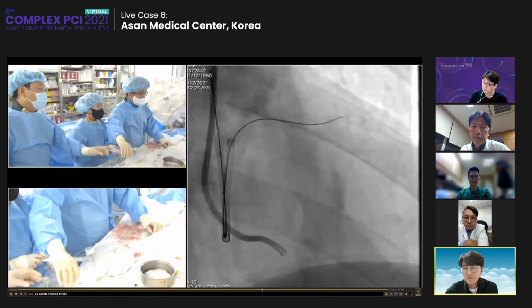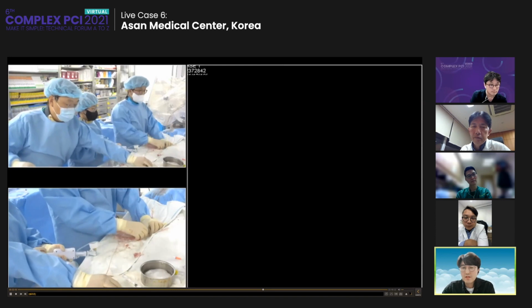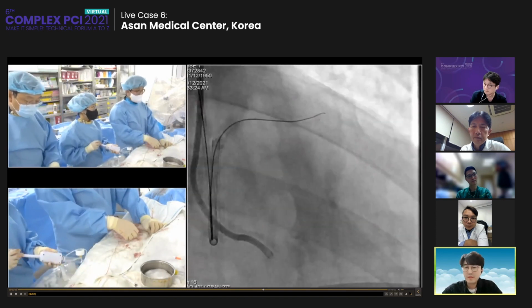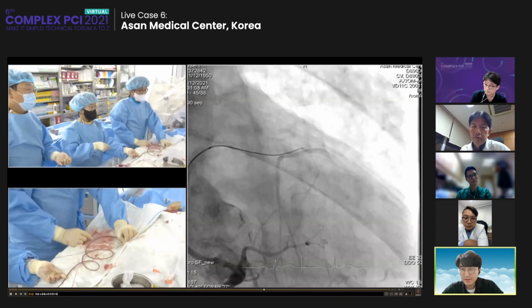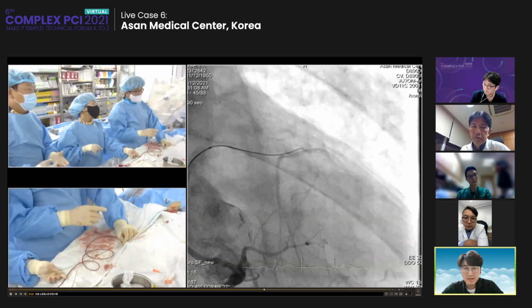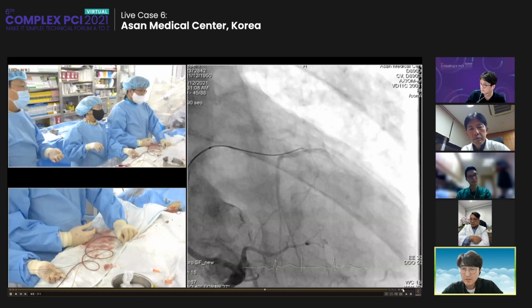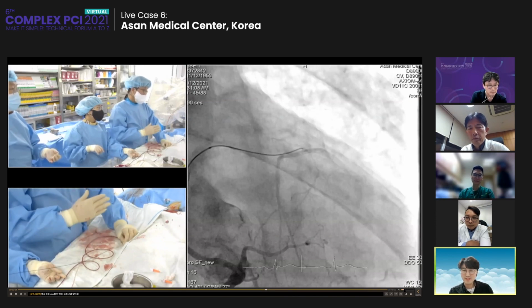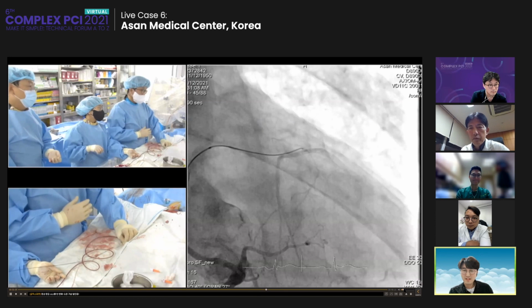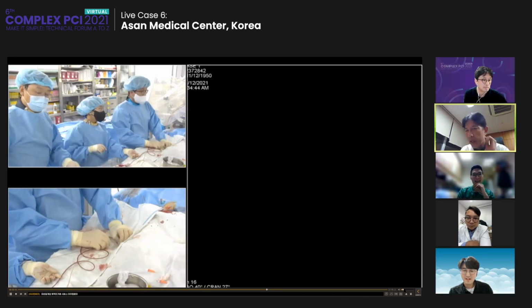May I ask how long a time interval is adequate for a retrial? Maybe the first trial failed. I think this case is just less than 2 months. Is it too short, or do we need more time to try the second trial? We definitely separate the first wire and the second wire in this position, Dr. Muramatsu, at the reflection point.